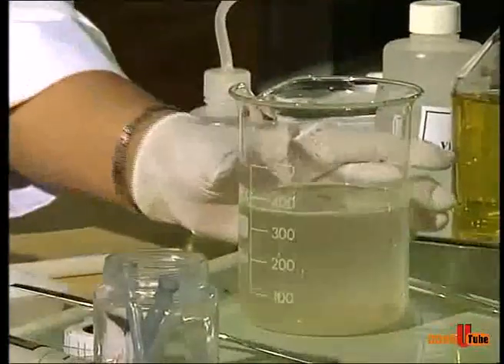Stir well and add a magnet. Then keep the solution on a magnetic stirrer to mix well.